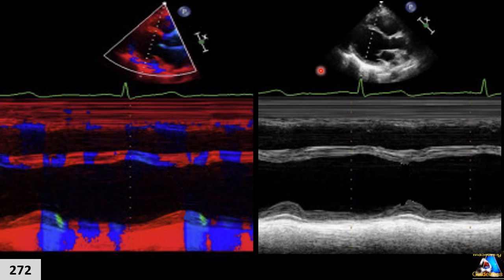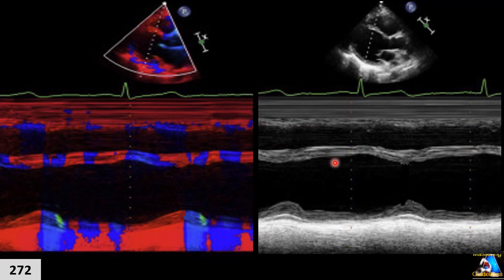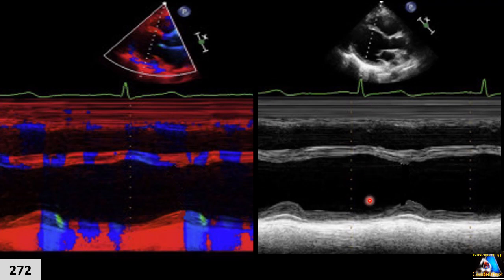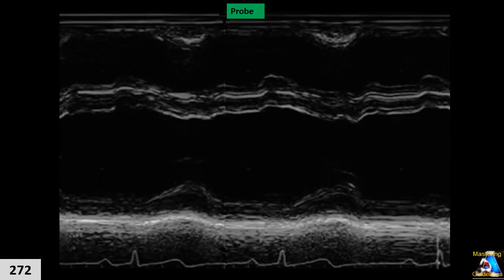Color M-mode creates an image from a specific line corresponding to the cursor. At every moment these data points connect and create a 2D image. The horizontal axis represents time, and the vertical axis represents distance. Each spot corresponds exactly with the cursor position. As you can see here, we have the free wall skin and subcutaneous tissue, right ventricular free wall, right ventricular chamber, septum, left ventricle, posterior wall, pericardial fat pad, and pericardium.